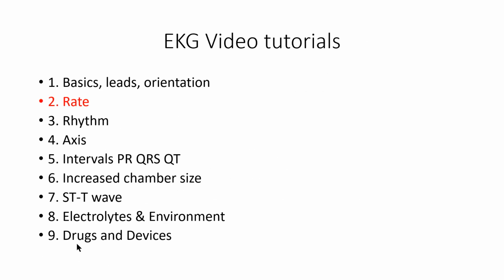Next up is going to be the 2.0 series, in which we'll learn the methods for determining the heart rate on EKGs.